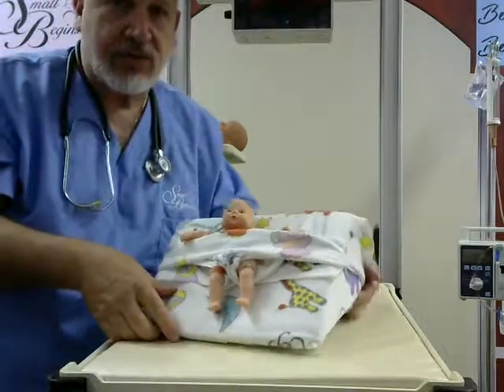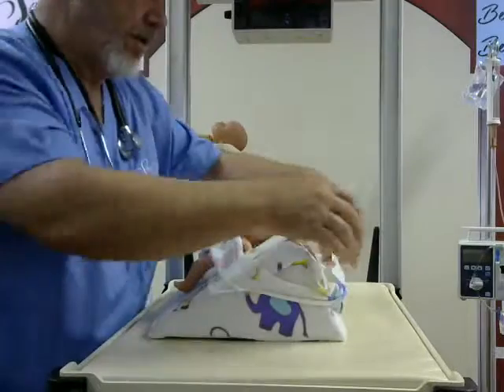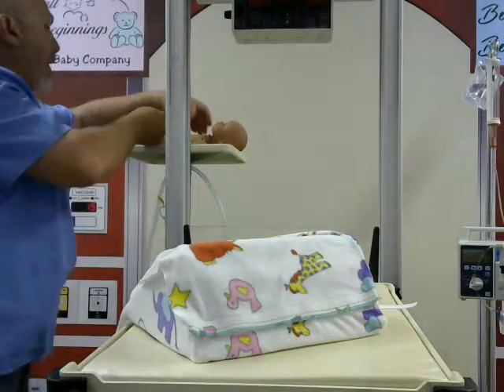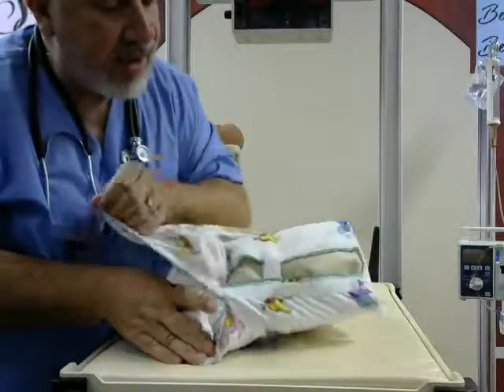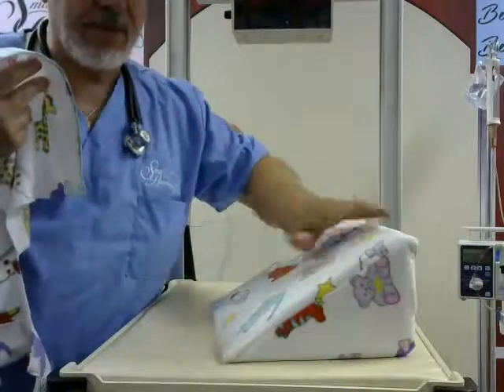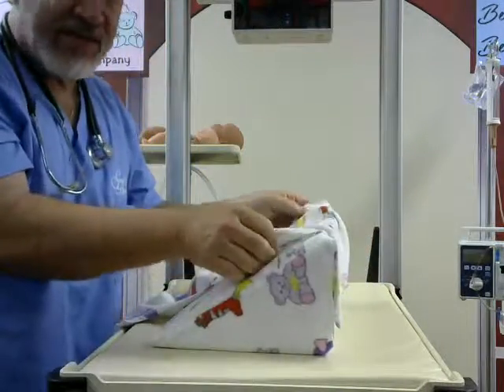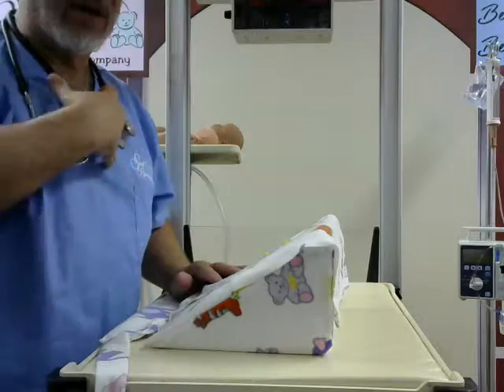Now we'll show you what it looks like on the preemie baby at a little more of a steep angle. You unattach, drop this down, grab your baby. Since we're going to be using this on a larger baby, we're going to take it off that way and flip it over to a much steeper angle. The goal here is to put the baby into a nice semi-flexed position so that you help them with that reflux problem.